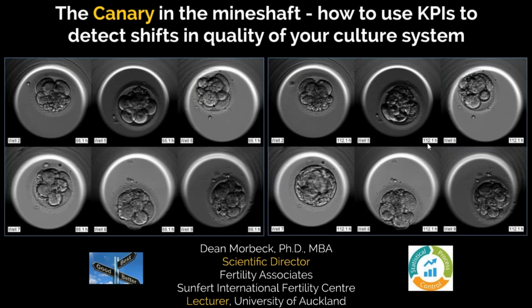Okay. Someone else said we have just changed from Irvine vitrification protocol and media to Kitazato vitrification protocol and media. Which KPIs could we use to track how it affects our performance? Yeah, that's difficult because if you're using it for blastocysts, and I'm just going to assume it's for blastocysts, then you have your survival rate, which we track routinely, and you should hopefully see a 95% or higher survival rate. And then also, we don't have an easy routine way to get the expansion of the embryos out of our system, but that's another KPI that you could look at, as far as what percentage are expanded at the time of transfer, if the timing is consistent, and then it really comes down to pregnancy rate.